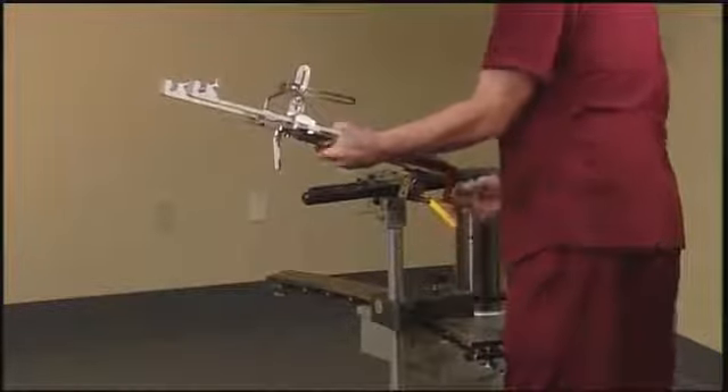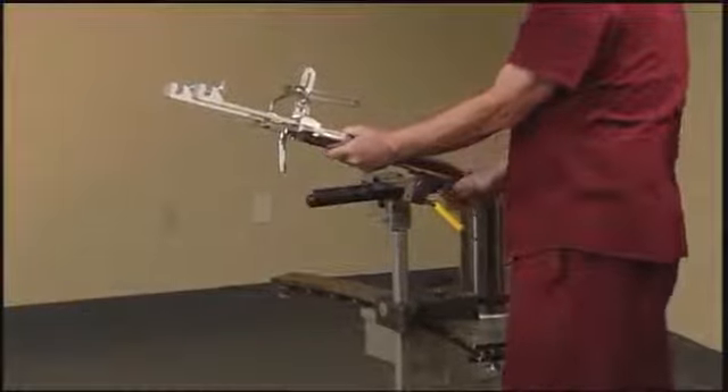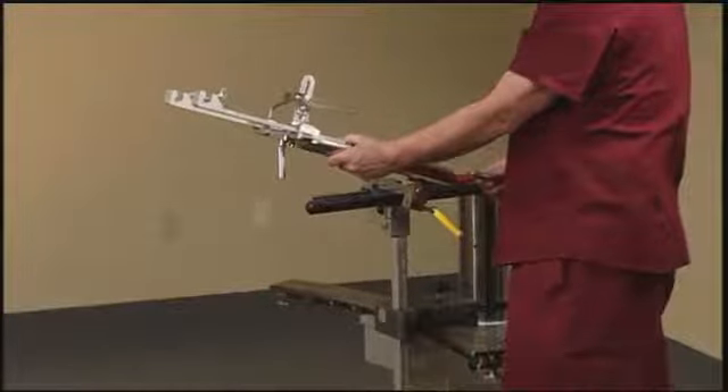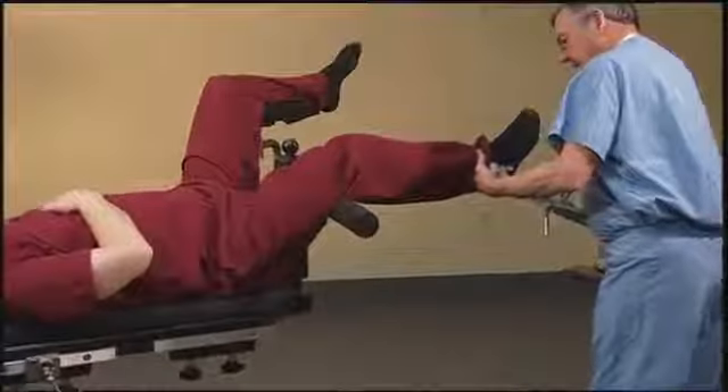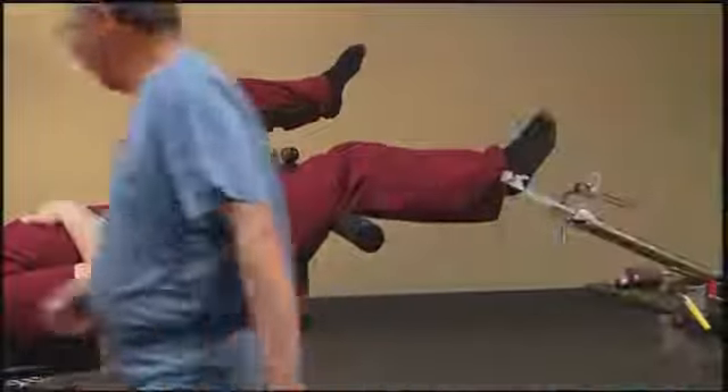In order to get the correct angle for tibia repair, the boot will be angled upward. In order to achieve the proper angle for tibia repairs, the traction unit will be lowered.